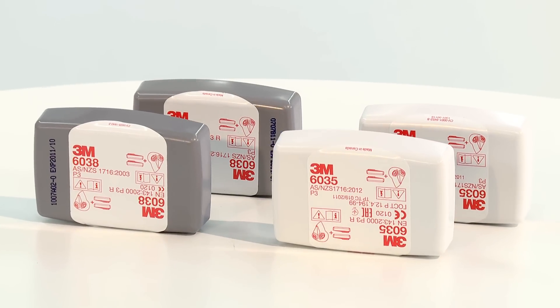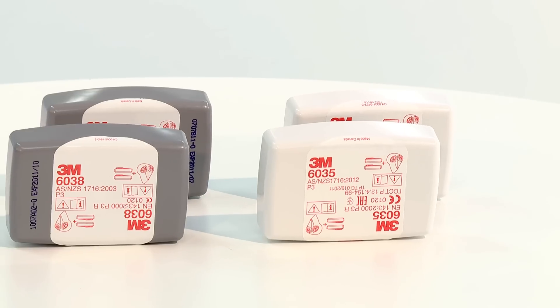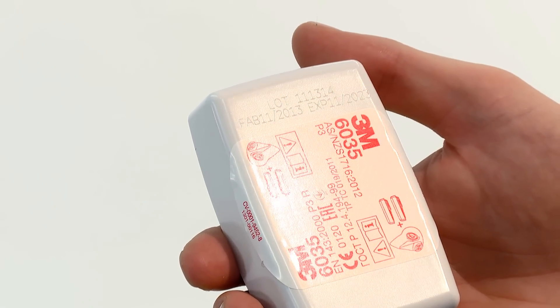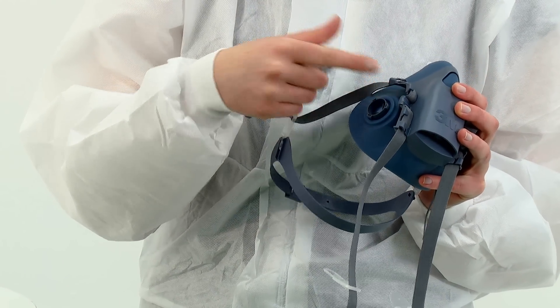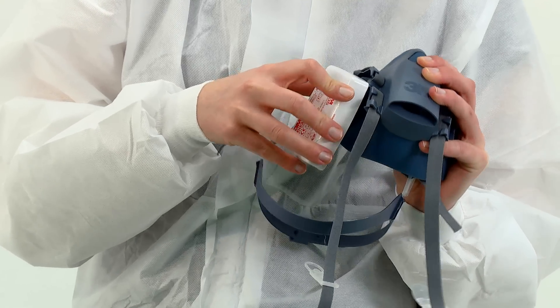Firstly, we demonstrate the fitting of encapsulated 6035 and 6038 series particulate filters. Before fitting, check that the filters are within their use by date. Align the line on the inside of the filter to the arrow on the mask and secure in place with a quarter turn clockwise. You should feel the filters lock into place.